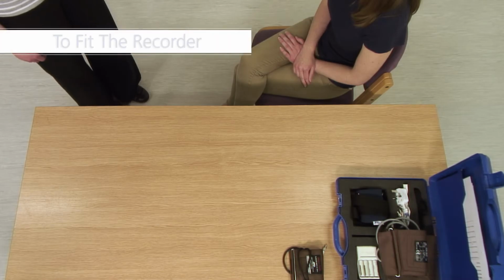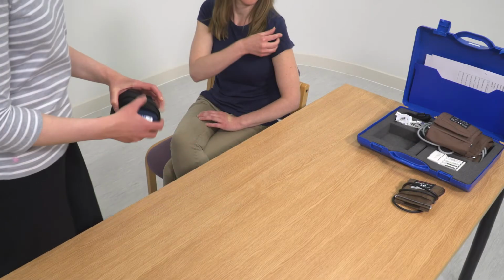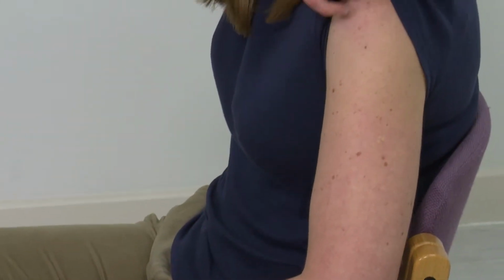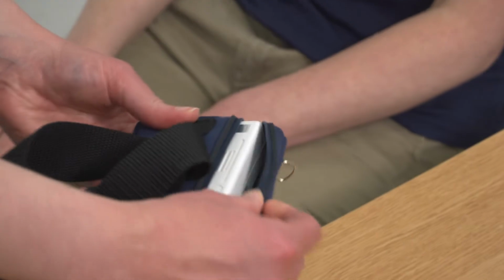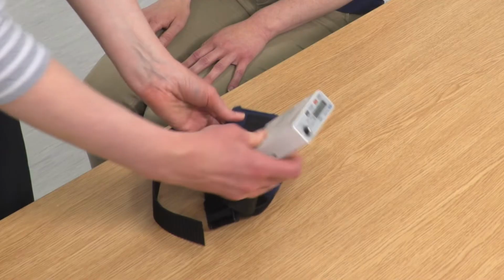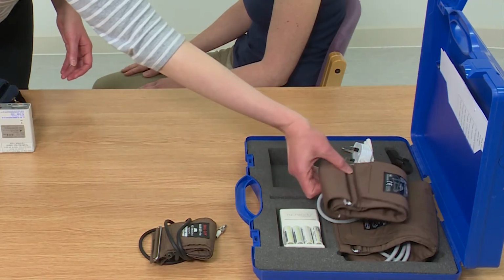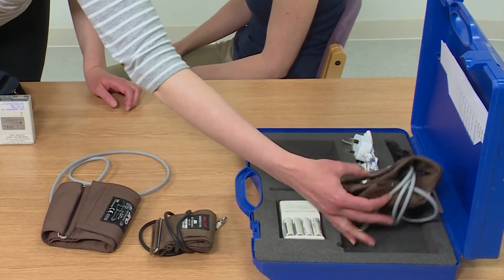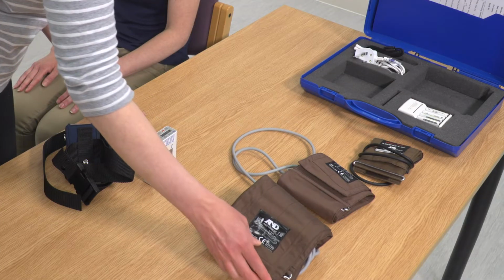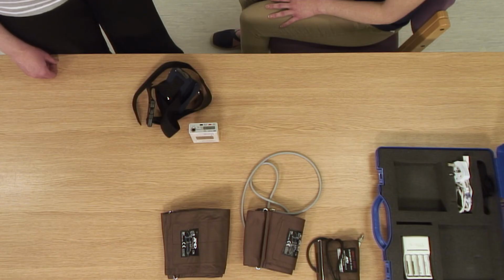To fit the recorder, ask the patient to remove their shirt or blouse so the arm on which the monitor is to be fitted is bare. Unless contraindicated, use the non-dominant side. In cases where there is a difference of more than 20 mm of mercury systolic between sides, use the arm with the highest pressure. For patients measuring their blood pressure at home, please use the same arm they use at home. Fit the appropriate size cuff.